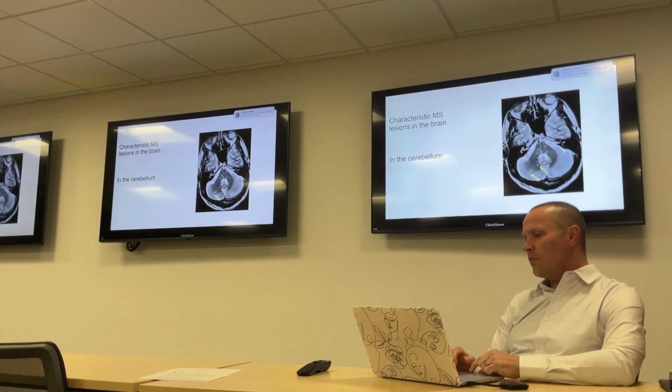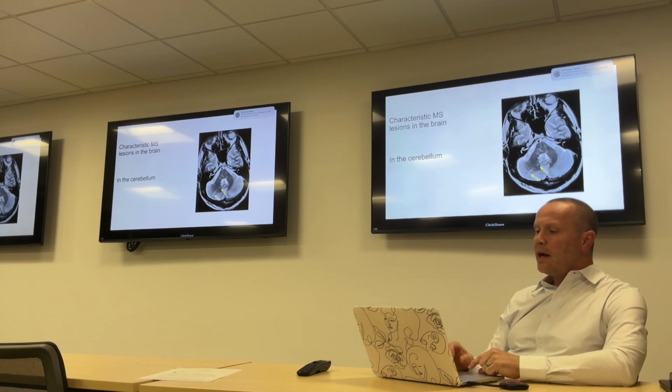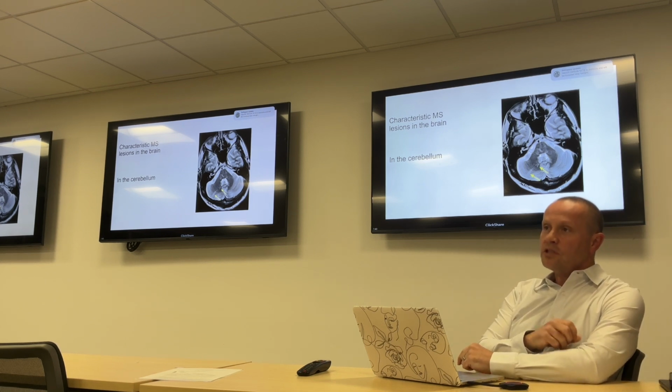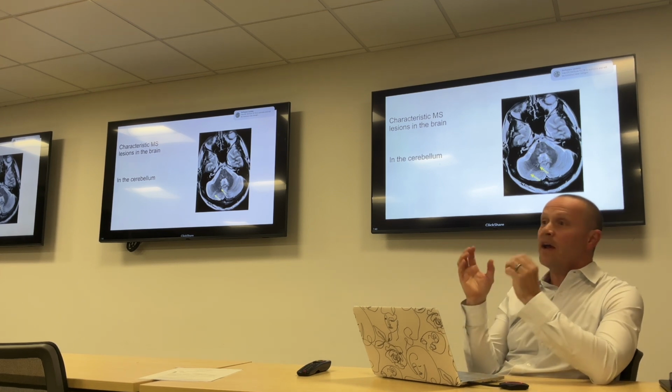He had a pretty severe burden of disease. Yeah. How would an injection change that? When we inject contrast, what we're basically doing is trying to look at those individual plaques and see if they are active. They won't cause more artifact, though, if that's your question.